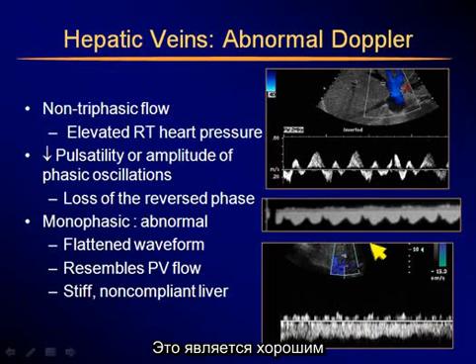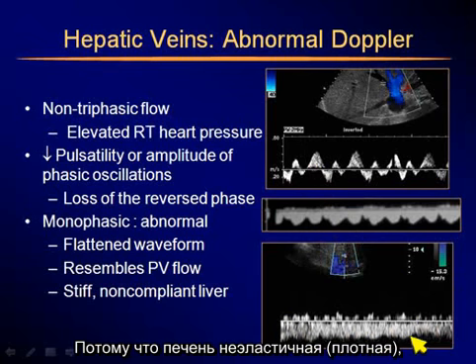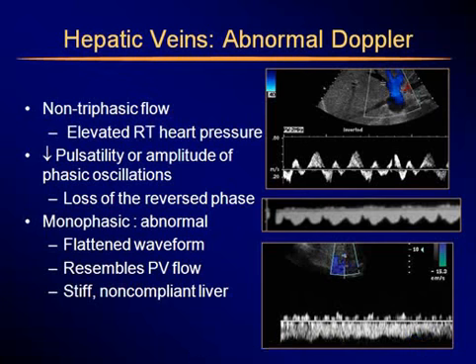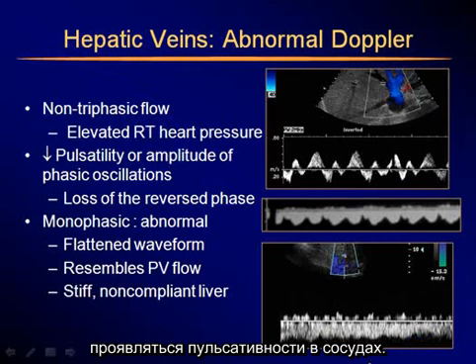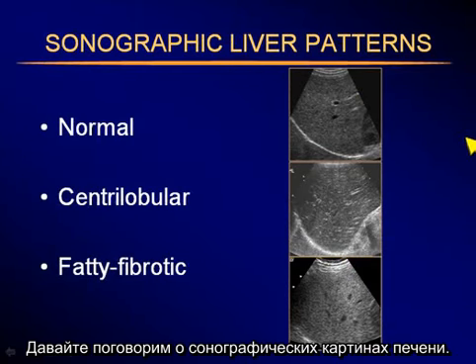It should be a nice pulsatile pattern, and all of a sudden now it's flat flow. It's because the liver is stiff, the liver is non-compliant, and does not allow this wave to be reflected in the vessels. So now let's talk about sonographic liver patterns.